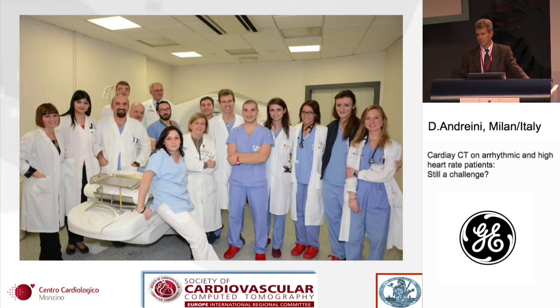Maybe one last question. What do you think are the remaining challenges in cardiac CT for you? That's a very good question. Still challenging for the anatomy is for sure the presence of a structure that leads to beam hardening artifacts, related to the limited spatial resolution along the Z plane.